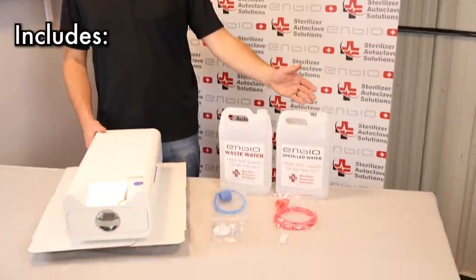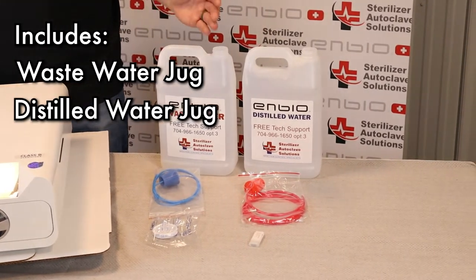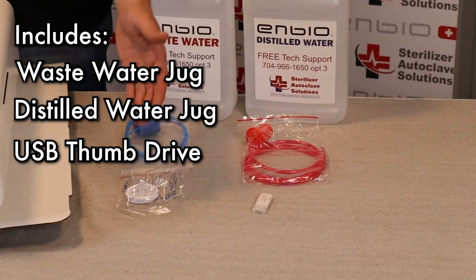The NBOS comes with a wastewater jug with connective tubing, a distilled water jug with connective tubing, a USB thumb drive, and a biofilter.